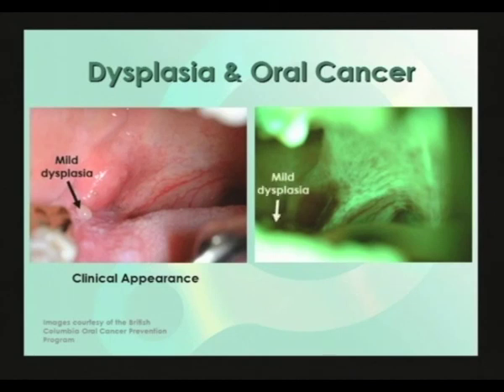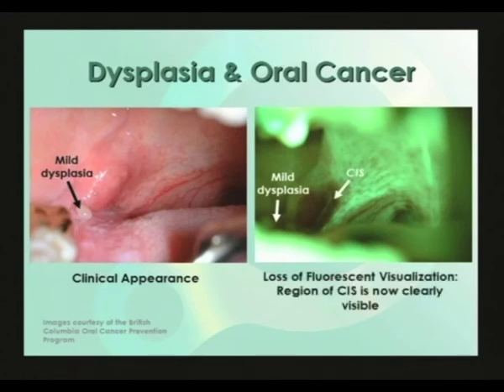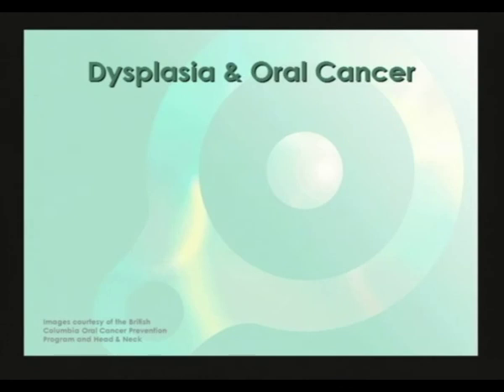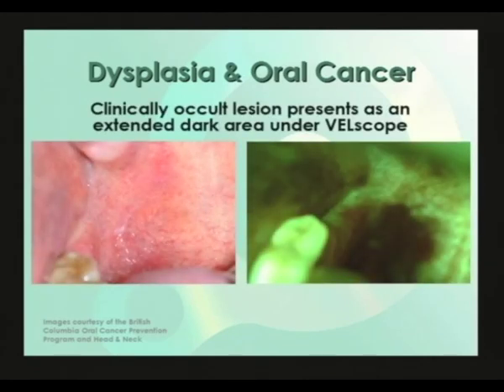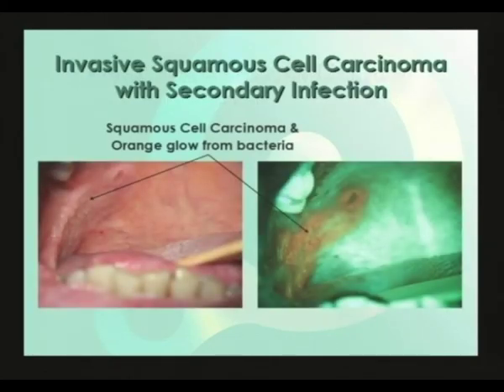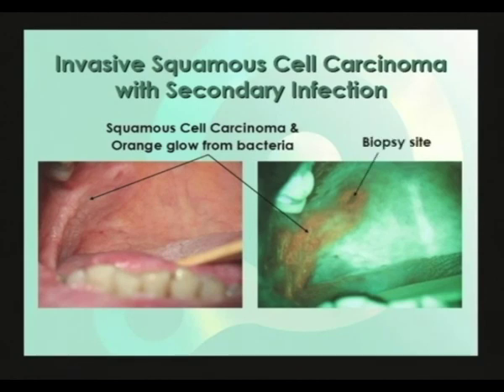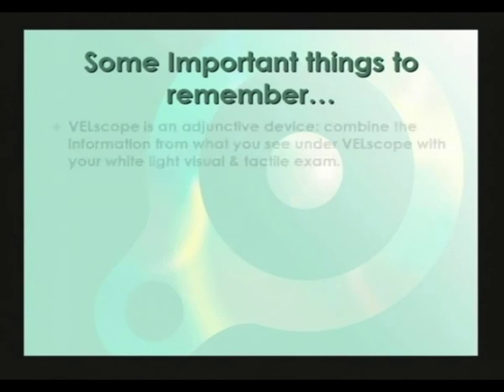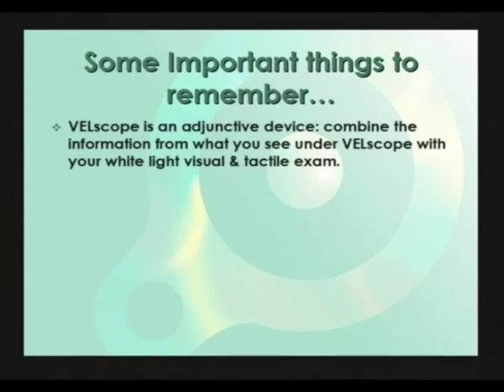The area that stood out under white light was found to be mild dysplasia. Interestingly, the area to the right that was not obvious in white light shows up as a dark area with quite well-delineated borders — biopsy confirmed carcinoma in situ. A classic clinically occult lesion is seen as a well-delineated dark area under VELscope, with biopsy also showing carcinoma in situ. A remarkable image shows invasive squamous cell carcinoma with a secondary infection — the bacteria give off their characteristic orange-red glow from porphyrin fluorescence, and the dark area at the top is a previous biopsy site.